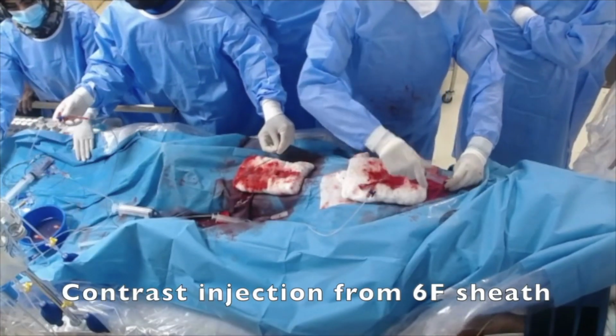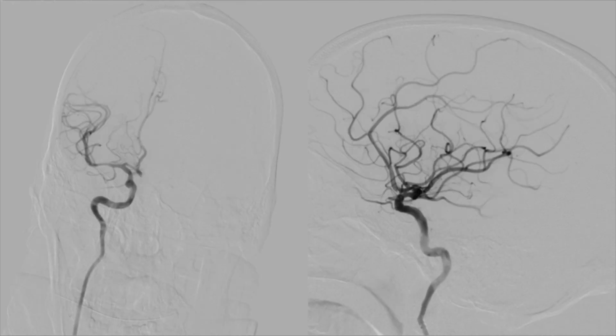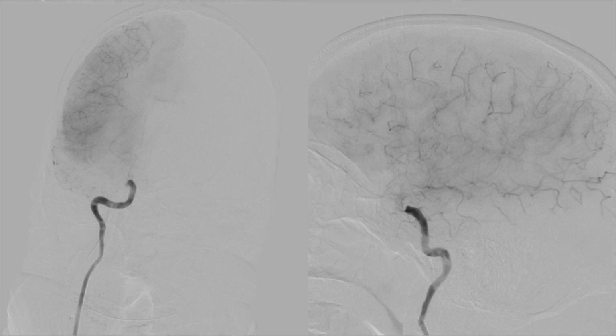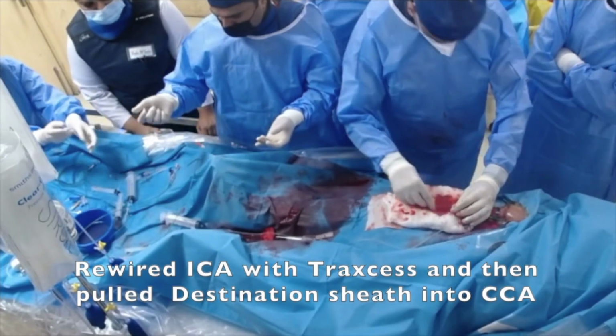So contrast injection from the 6 French destination sheath confirmed that we had good flow in the cerebral circulation with some spasm or ICAD seen in MCA M1 territory, and some slow flow seen in the carotids, which I thought was due to the spasm.